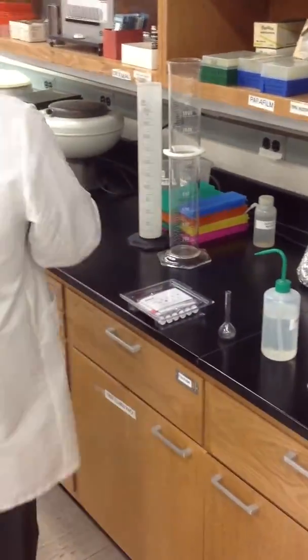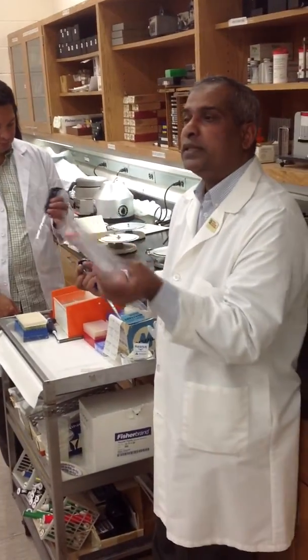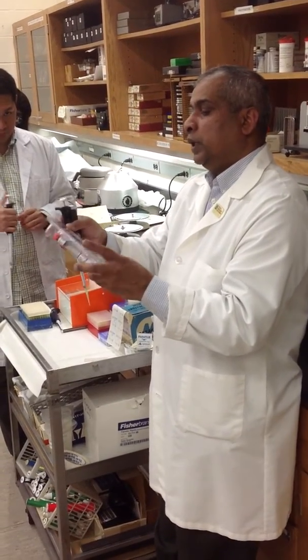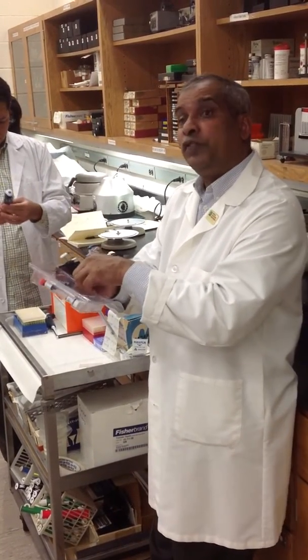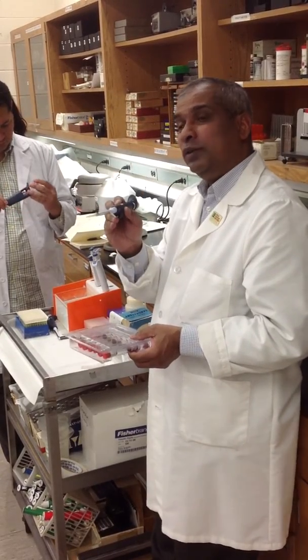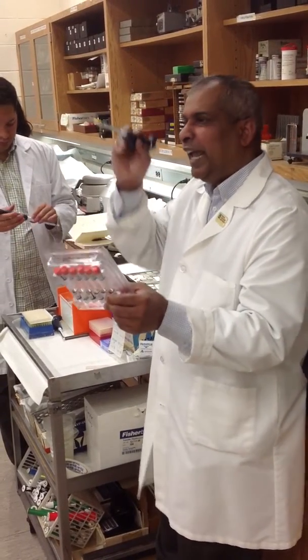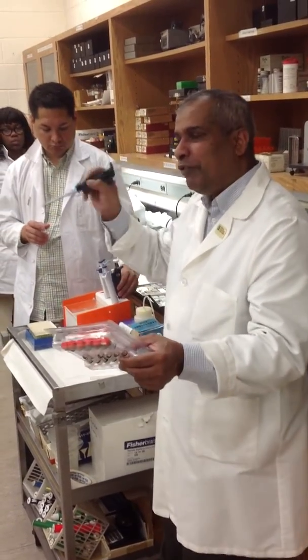Our blood we buy, right? So these are controls that we can use on the machines. It's commercial blood, but you still have to protect yourself, right? So we buy it with different levels of control, and the levels are usually, you get a low abnormal, you get a high abnormal, and you get a normal. And you will see on there L, N, or H. Okay? So the counts are different in each.